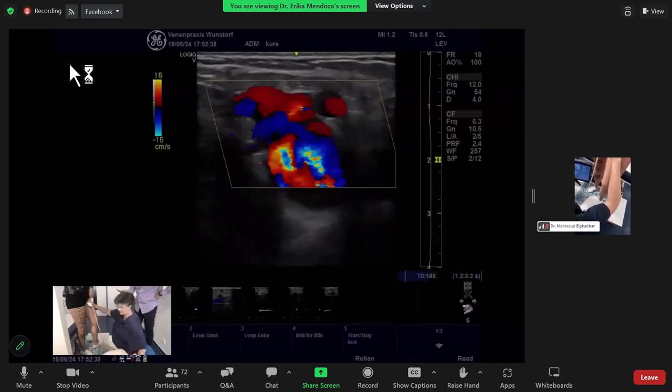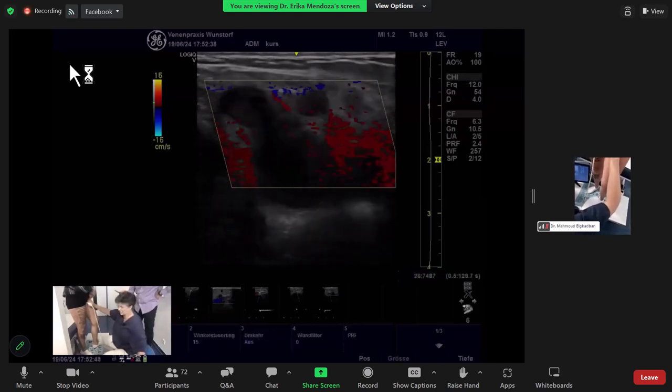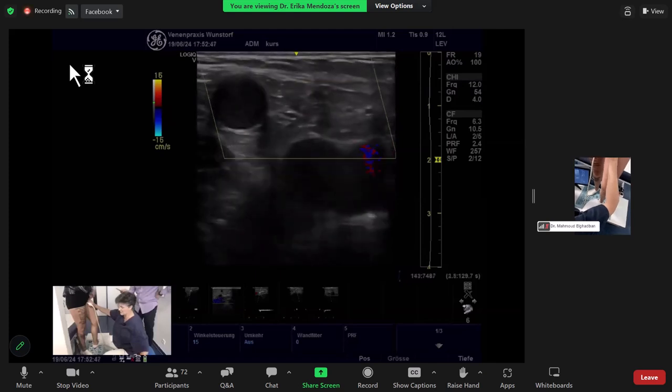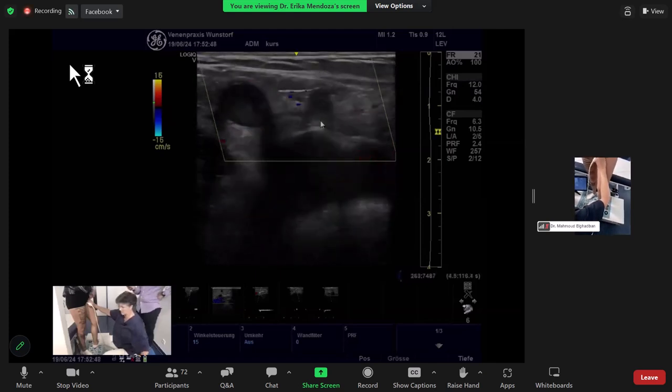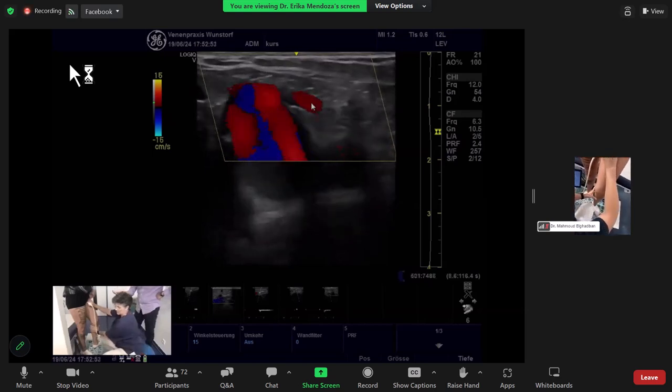You see in the color, you see that best. It comes out here, very clear, and one comes from this accessory, from this epigastric vein here. This is also filling the leg.